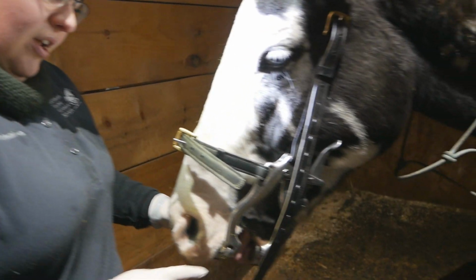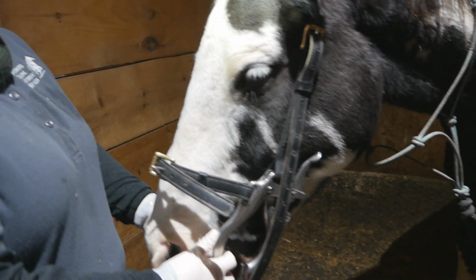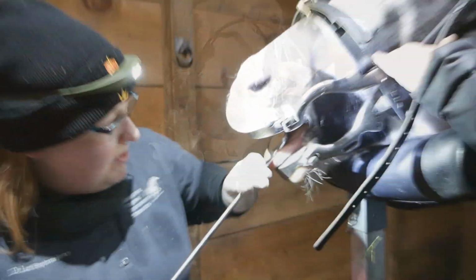All right, we're gonna try and look in there. He's definitely got some sharp points. We'll grab the stand and see. Sometimes they just need a little extra time to decide if they're gonna open up their mouth.